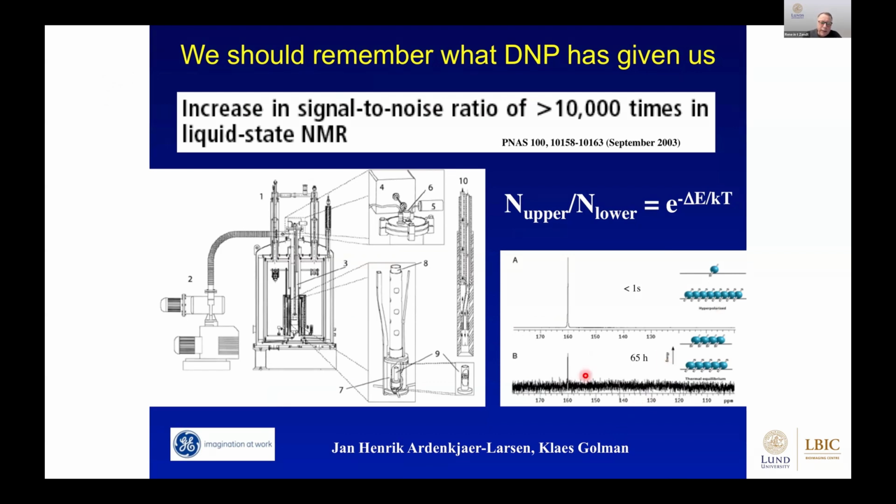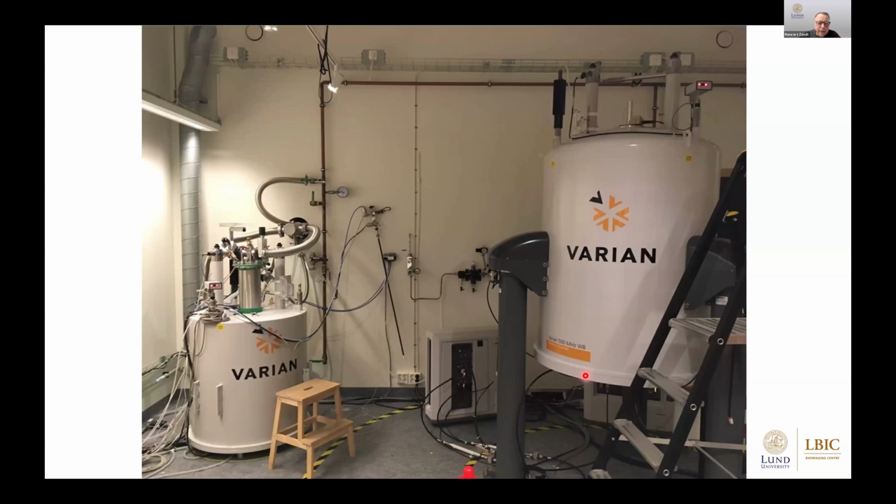How it would look in the lab in the early days is that this is an 11.7 Tesla vertical magnet system. This is what we call the polarizer. It's also a magnet. This one's at 5 Tesla; the very first one was at 3.3. But the message is that this is the machine producing the contrast agent. Once you take it out, you can transport it to the magnet, add it to the cells or whatever you want to do, and do your studies.